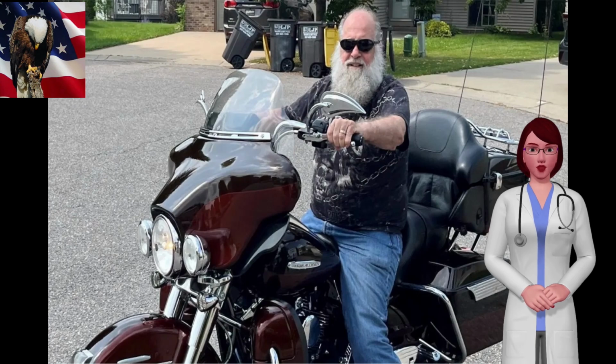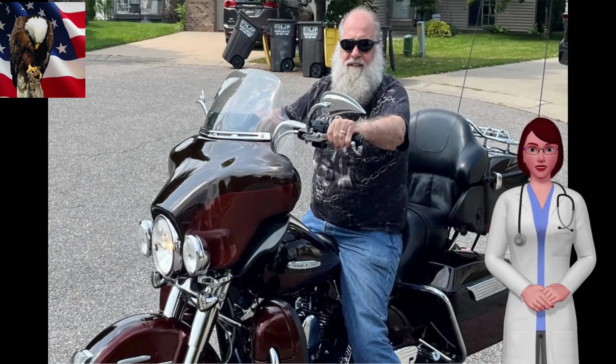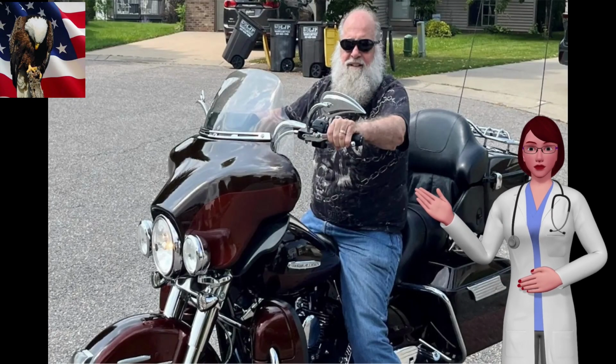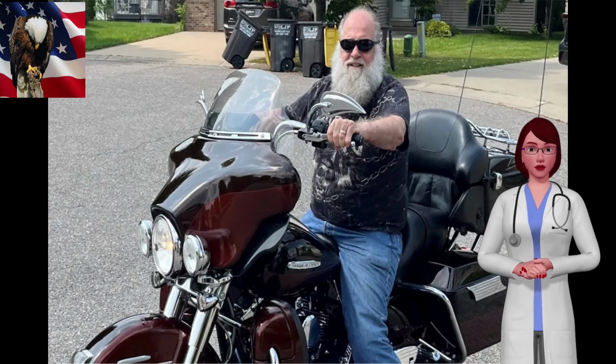Woods and Jacob Ziegler, MD, his orthopedic surgeon at Mayo Clinic Health System in Mankato, recommended bilateral knee replacement, a surgery to replace both of his knees at the same time. Dr. Ziegler had recently become the first surgeon in the health system to begin utilizing new sensor technology licensed by Zimmer Biomet through a partnership with Canary Medical.